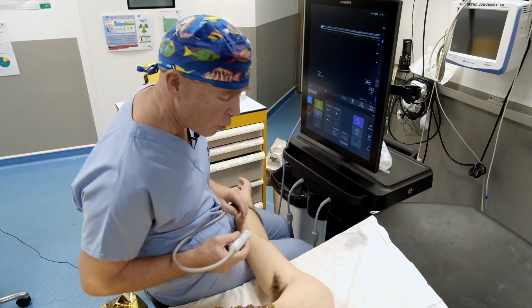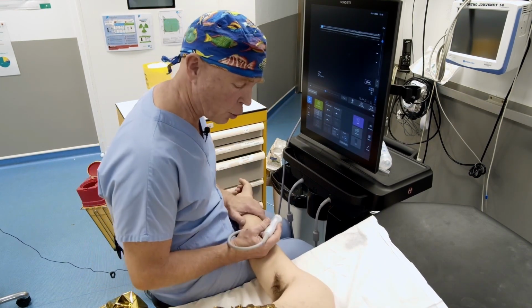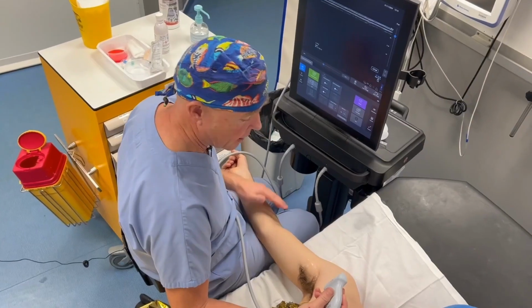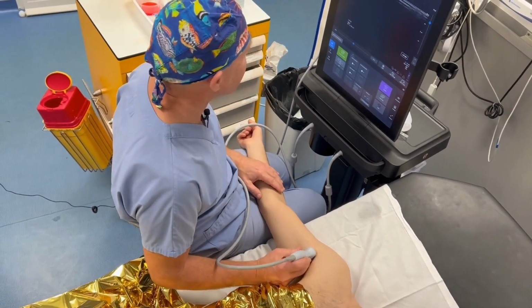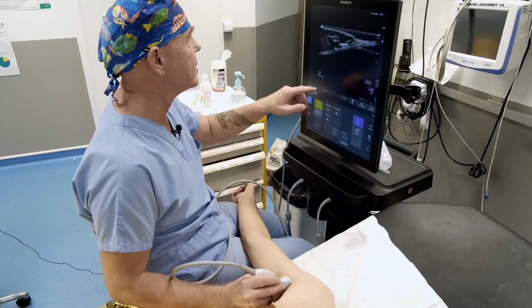So let's start with the axillary block. As you can see, I position myself like this, I take the patient's arm a little onto myself. My right hand is stable and fixed, slightly stabilized on the wrist so as not to move my image. And I start to scan and follow. Here we see a slight anatomical variation, but it more or less matches up.